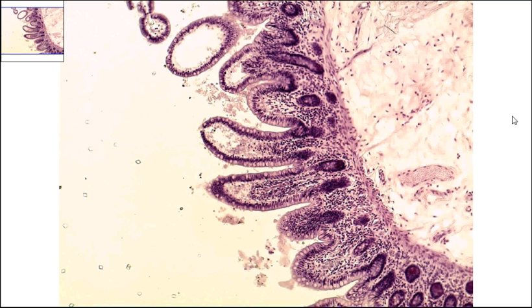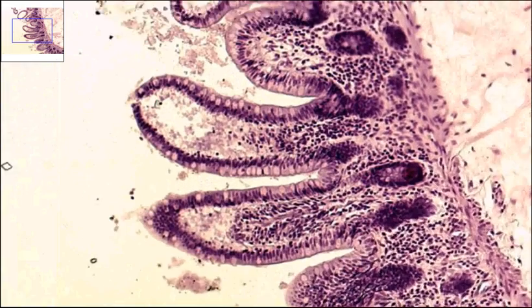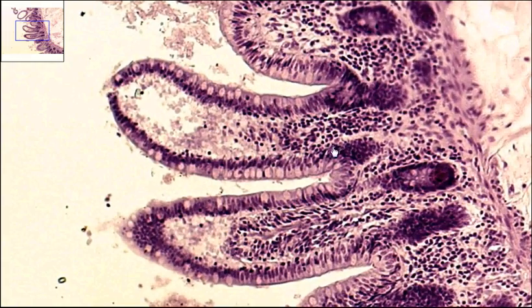If you want to zoom in, we can see a little more detail to these pieces right here, which are the simple columnar. Right where the mouse is tracing, this layer is the simple columnar epithelium.